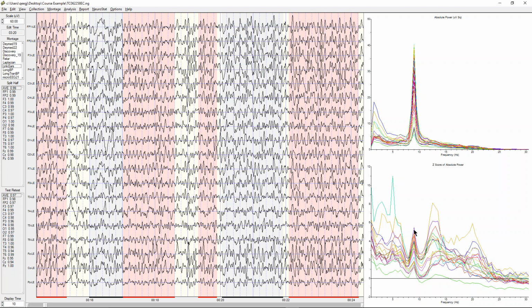You can see that I've got 3, 4 and 5 standard deviations above expected values at that frequency, at each of those locations. What this is telling me is mostly that her peak alpha frequency is slow enough that it's showing up as statistically significant. But also the voltage is high enough that that's causing that as well.